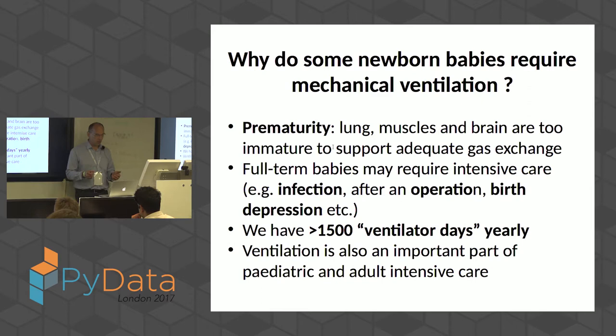As a big neonatal unit in Cambridge, we ventilate approximately 1,500 ventilator days a year, where one patient ventilated for one day is one ventilator day. So we ventilate a lot, similarly to other big neonatal units. And ventilation is also an important part of adult and pediatric intensive care.